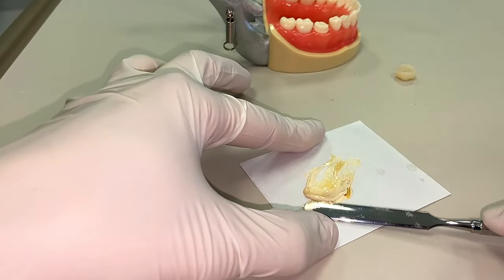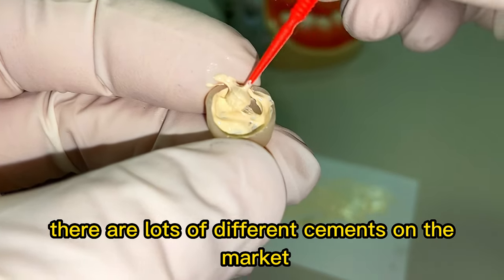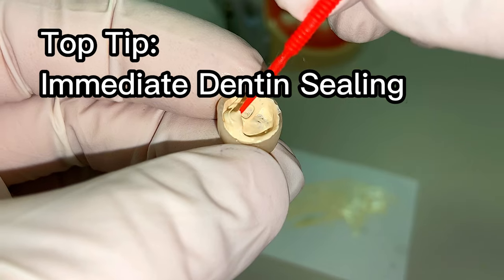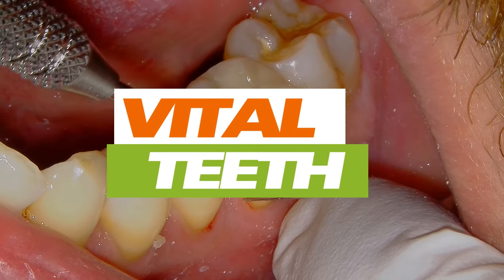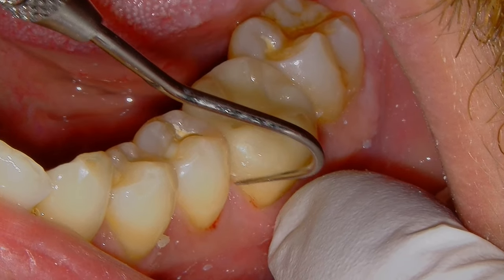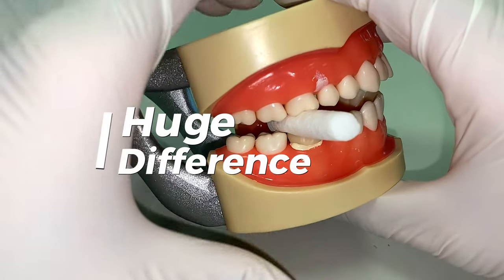Tip number eleven: cementing. There are lots of different cements on the market. If you're not familiar with immediate dentin sealing, it might be something you want to think about for vital teeth. I've had this on my own cracked teeth and it makes a huge difference in post-operative sensitivity.